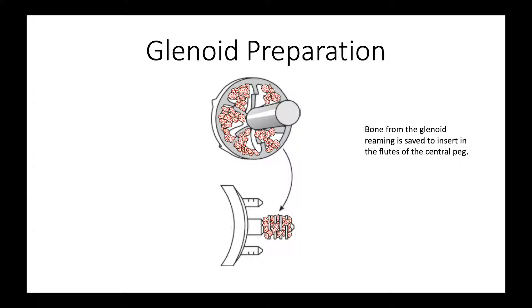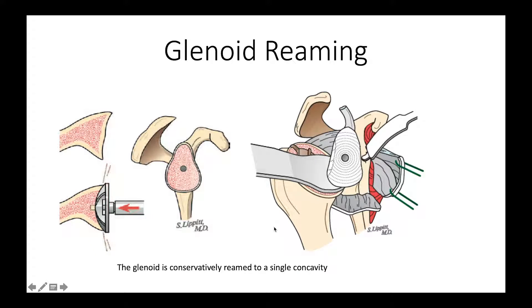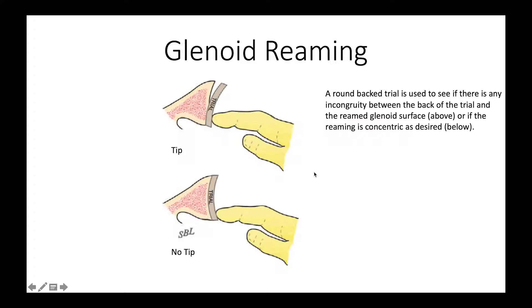When we do the reaming, we want to save the reamings because we're going to put them in the flutes in the glenoid component. We can check and make sure that we've reamed the glenoid to a single concavity, as shown here. One of the ways we can check it is to use one of these roundback glenoid trials and make sure that it doesn't tip when we press on one edge or the other. It should fit securely just on the surface without any pegs or keels so that we have a good concave-convex match.